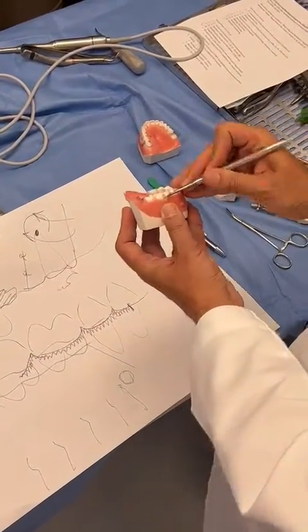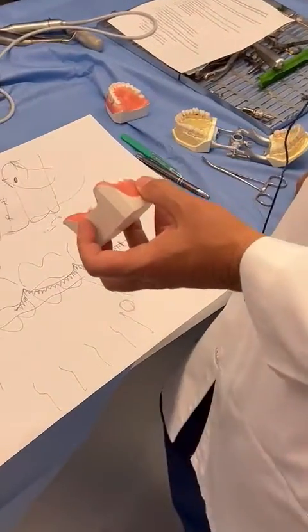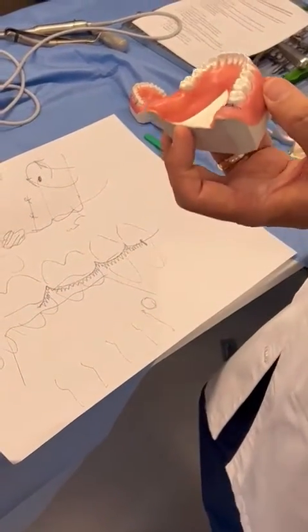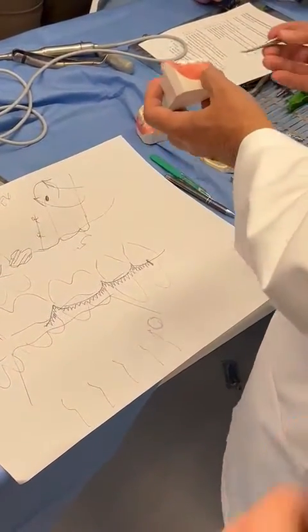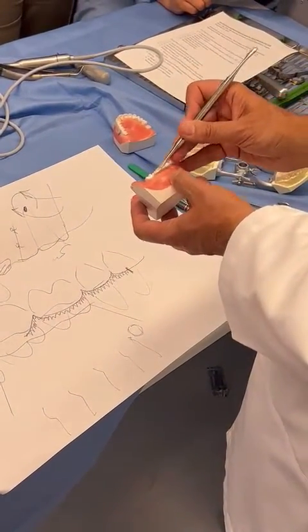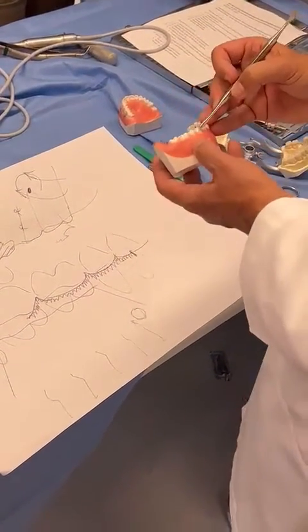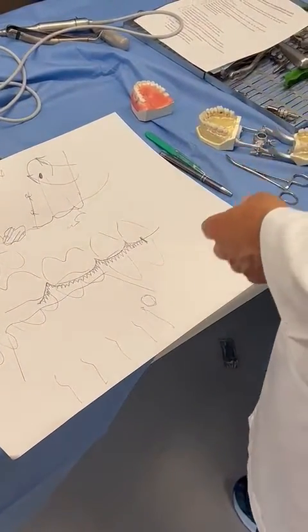These are actually, I like these. Dr. Lonergan gave me a set of these, but I don't like to teach with them because they're not in the head. And this is tabletop teaching, but this is kind of nice for what we're doing. Thank you for bringing this. This is very good for that. So remember again, push, push, push, flip, pry, pry, pry. But you're pushing down on the bone. I'll show you, I'll tell you why.